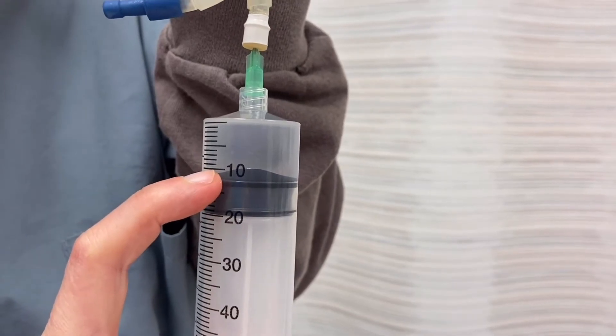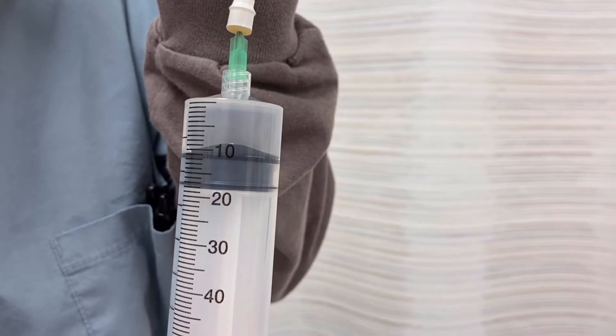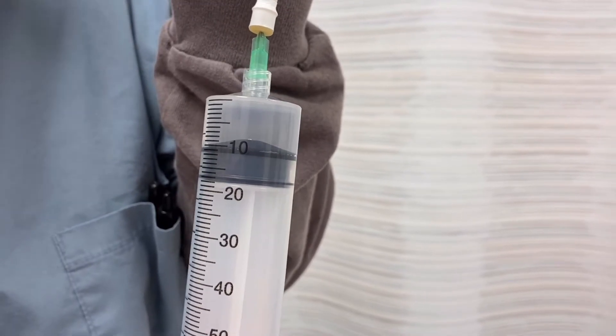I would like to give 10 mils, so I'm going to make sure that the top of the black stopper reaches the top of the line of the number 10.